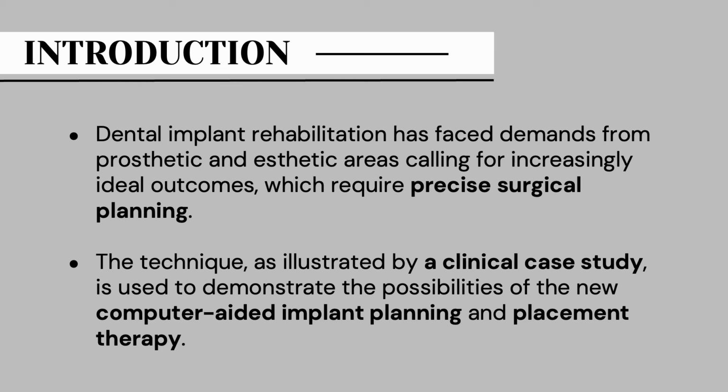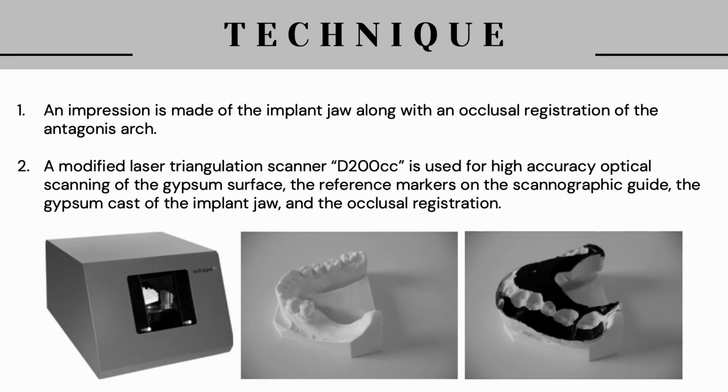Dental implant rehabilitation has faced demands from prosthetic and aesthetic areas calling for increasingly ideal outcomes, which require precise surgical planning. The technique, as illustrated by a clinical case study, is used to demonstrate the possibilities of the new computer-aided implant planning and placement therapy. There are 8 steps for this technique in this study.